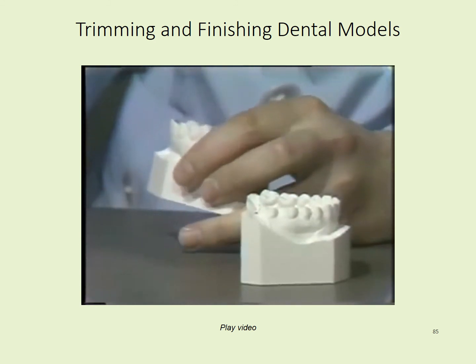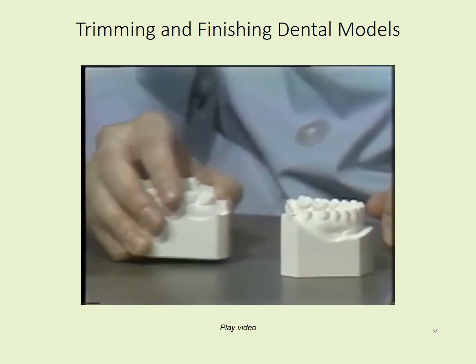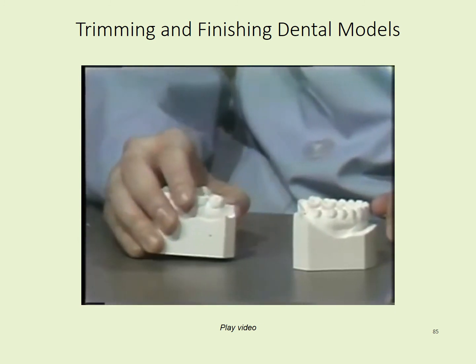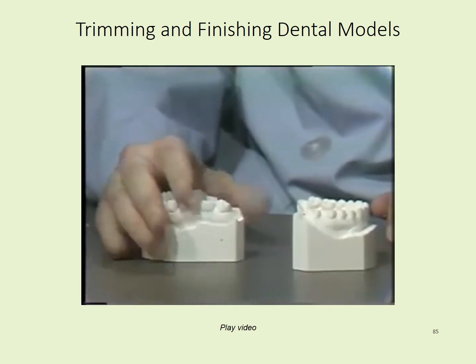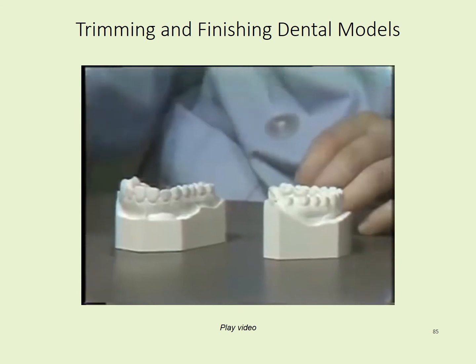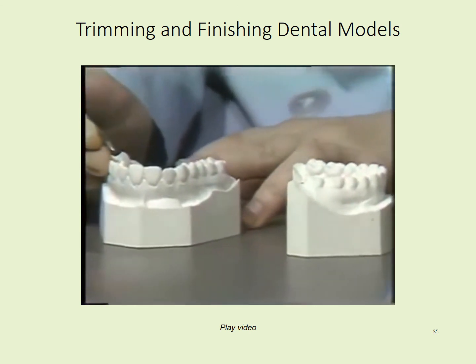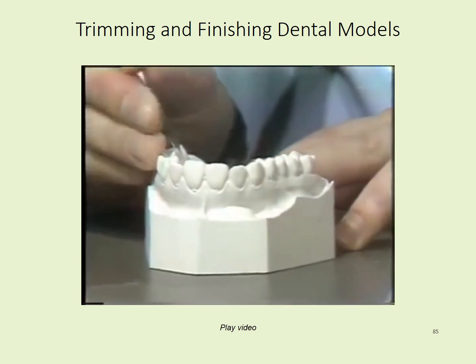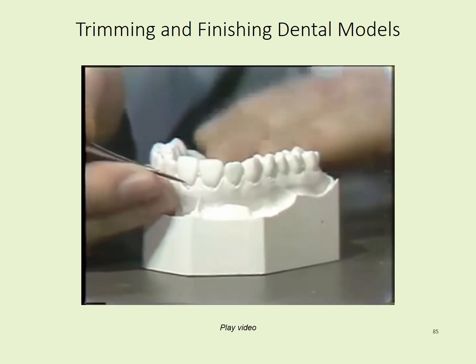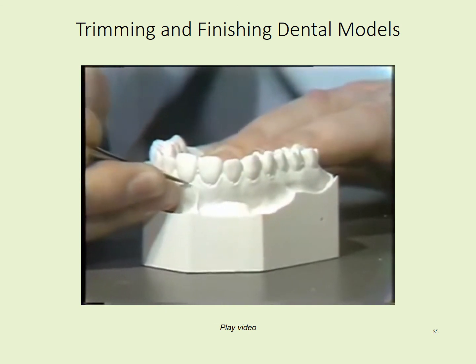And using the sandpaper, make sure that you place it flat on the table and rub the flat surfaces of your model along the sandpaper. This will help ensure that you keep your angles sharp. You can use a number 7 spatula to remove any imperfections such as bubbles along the gingival borders. The tongue space should be cleaned out using a rotating stone or a lab knife.